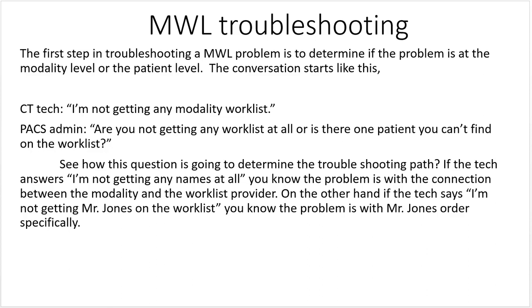Now see how this question is going to determine the troubleshooting path? If the tech answers, I'm not getting any names at all, you know the problem is with the connection between the modality and the worklist provider. On the other hand, if the tech says, I'm not getting Mr. Jones on the worklist, you know the problem is with Mr. Jones's order specifically.